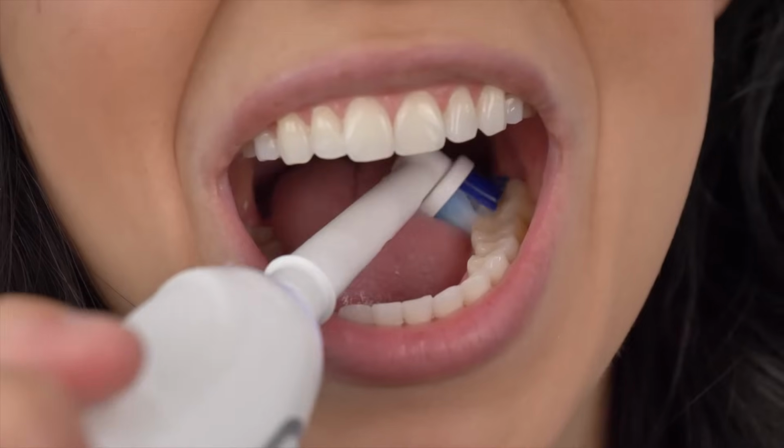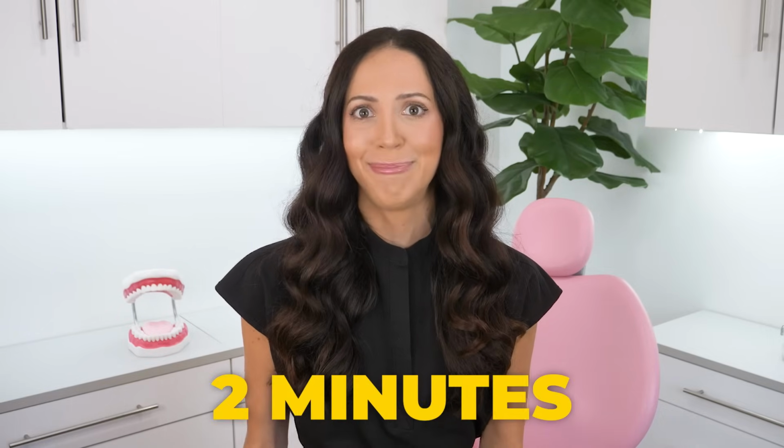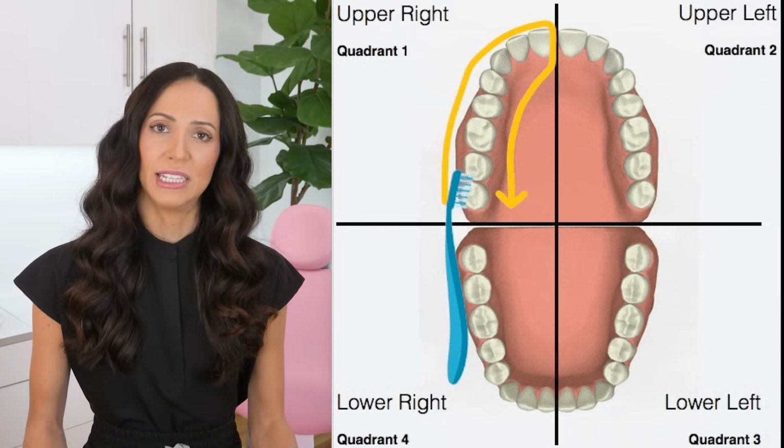Now, most electric toothbrushes have some kind of built-in timer. It either beeps or pulses in some type of time increment. Always refer to the brushing instructions that came with your electric toothbrush for exact details on how yours works. But for this one I'm using, it pauses every 30 seconds. So since you should be brushing for 2 full minutes each time for your entire mouth, you will do 30 seconds and 30 seconds on the top and 30 seconds and 30 seconds on the bottom.